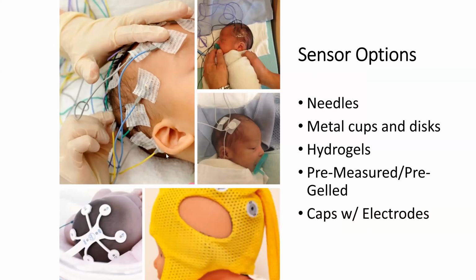So we're really lucky now. I've been teaching aEEG for almost 16, 17 years now. There weren't as many options available. There were needles, there were cups, there were sticky hydrogels that didn't work very well, but there are so many new cool tools out there that really pre-measure for you, are pre-gelled for you, are much more stable and secure and safe, but really there are pros and cons to all of them, and I would just encourage you to investigate and evaluate them and figure out which ones are best for your department.